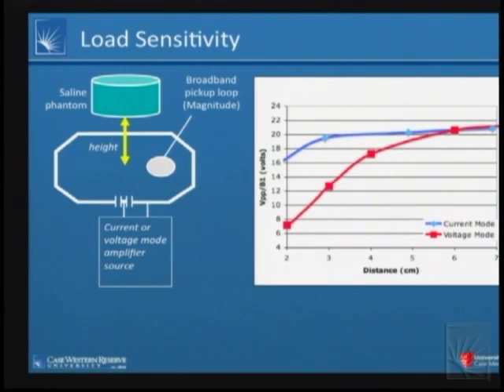So it doesn't matter what you put in the magnet now. Now we don't need to do that adjustment at the beginning. Just put the patient in the scanner and go. We don't need to worry about anything.